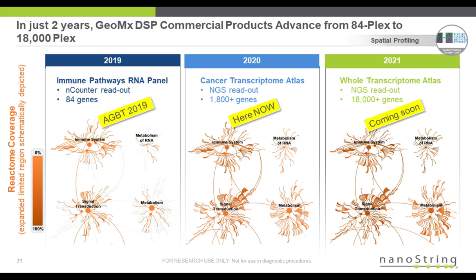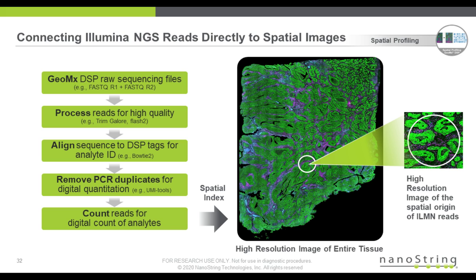So in that kind of manner, it allowed us to generate infinite-plex spatially resolved technologies. You can see over the last 2 years, as shown here, we've gone from 84 genes in space to now routinely in the lab, I'm doing almost 21,000 mRNA probes in space. The work that Chris and Rob are going to show you is right there in the middle. It's around 2,000 genes in space that we'll be looking at, and Rob and Chris will show you.